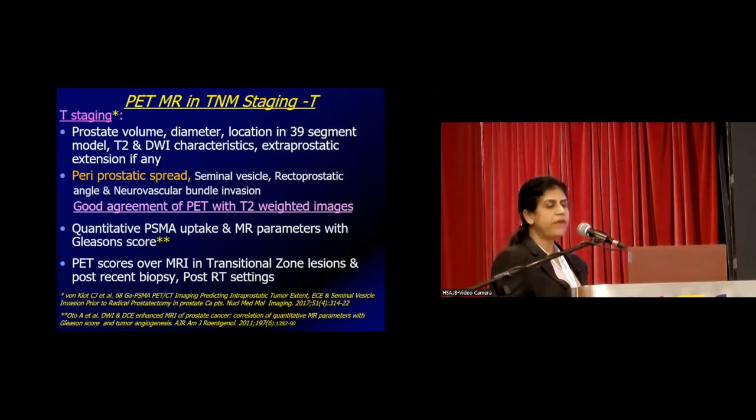And we definitely have a great role to play in transitional zone lesions and in patients who have been subjected to a recent biopsy, because there the MR can be fallacious. Similarly, there is some amount of false reporting in the post-RT settings in patients with prostatic carcinomas from the MR side.